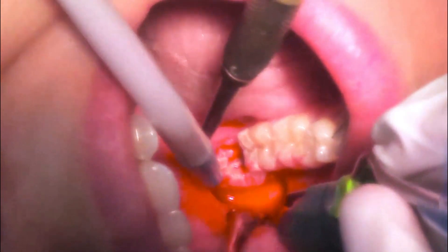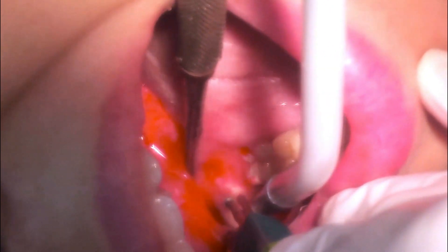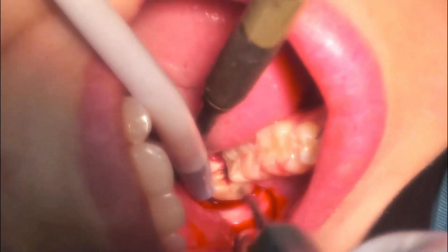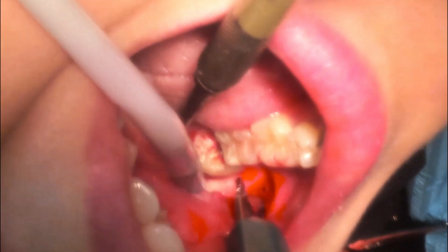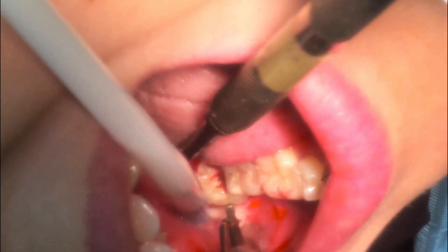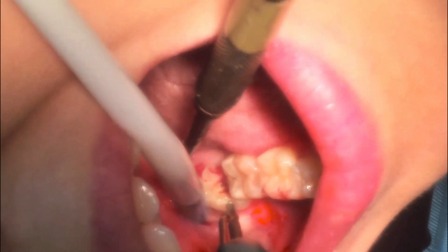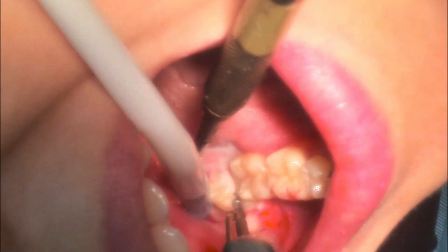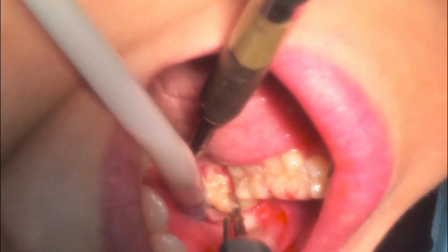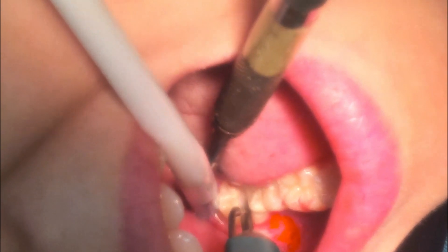Here I am using a 702/703 bur for bone guttering around the wisdom tooth. As mentioned, there were three roots, so my aim was to split this tooth into two parts and then split the roots into three parts. I am splitting the crown very carefully and going slightly deeper to split the roots. Unfortunately, because of the three roots, only the crown broke off, leaving three roots which I had to split separately.